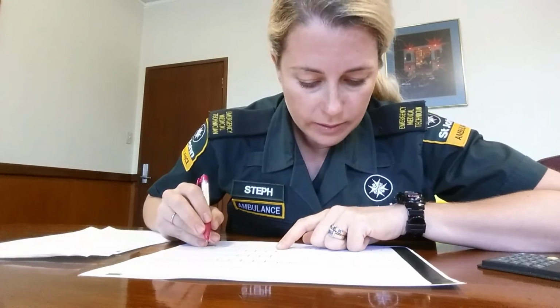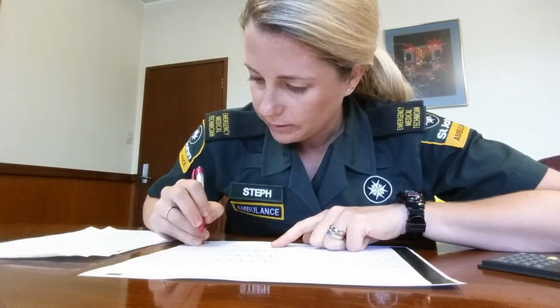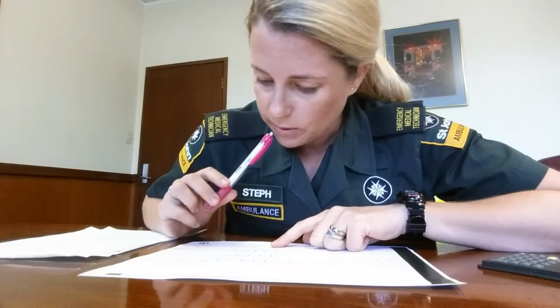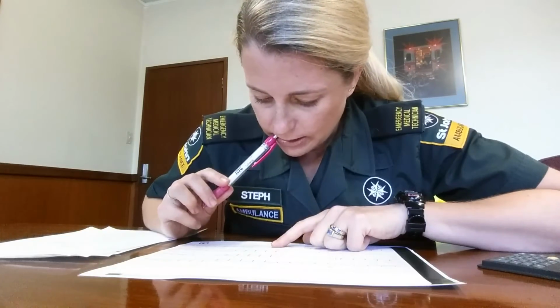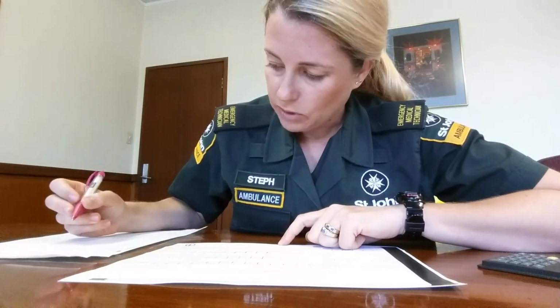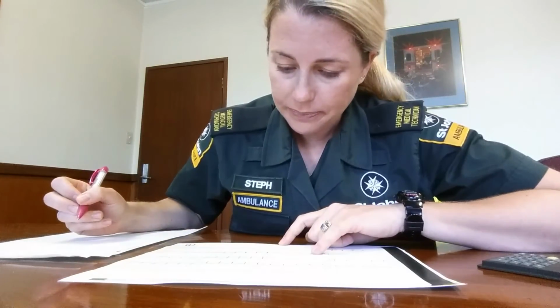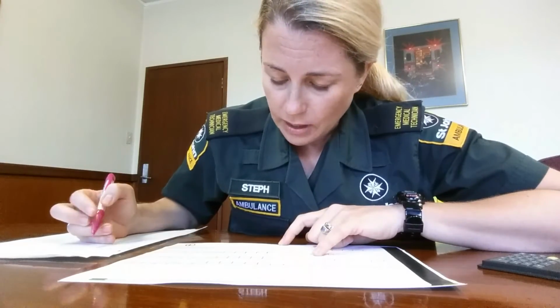And then the T waves, they should be asymmetrical, and they should be positive, and they shouldn't be more than 2/3 the height of the R wave, which they're a bit peaky, a bit high, so we're definitely seeing some signs of changes there. As for the morphology, we've got no wide QRS.